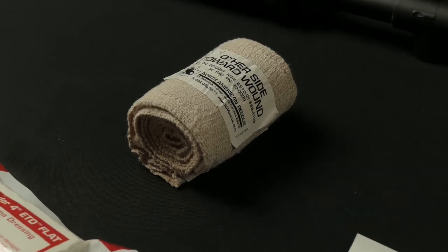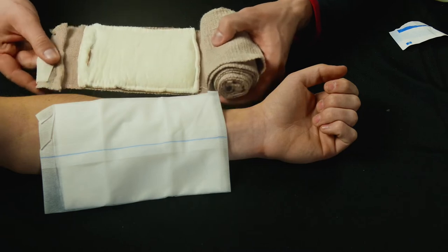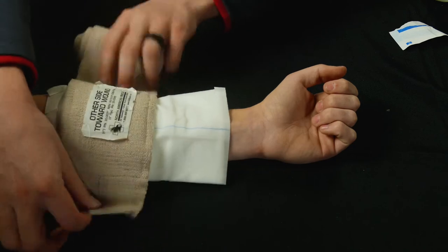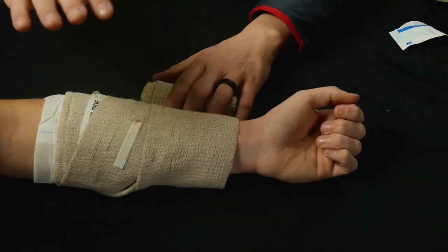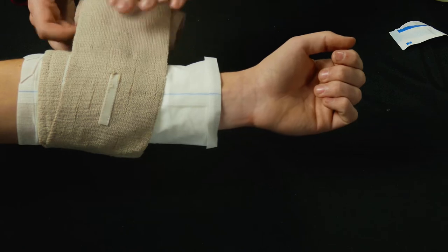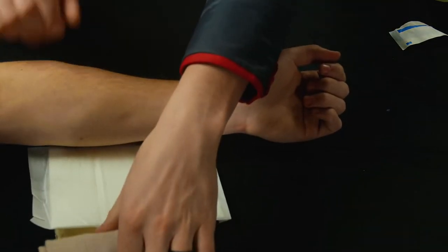If you have a severe bleeding kit with pressure bandages, you can also use those as a bandage — just make sure you don't put it on too tight. It does have a pad that will help absorb a little more blood. I'm not using it as a true pressure bandage right now; I'm just wrapping it loosely, so its only job is to hold the dressing in place. It's a bit overkill here since it's more expensive and I don't need the pressure capability, but if it's all you have, definitely use it.